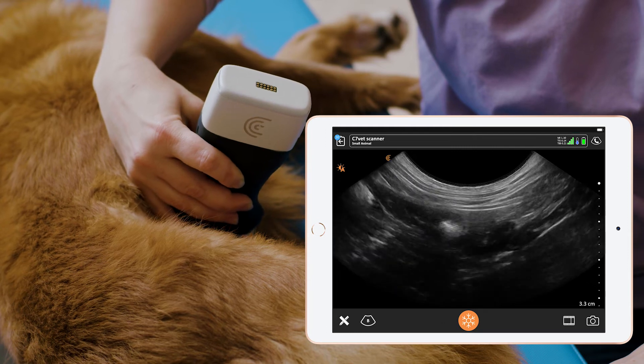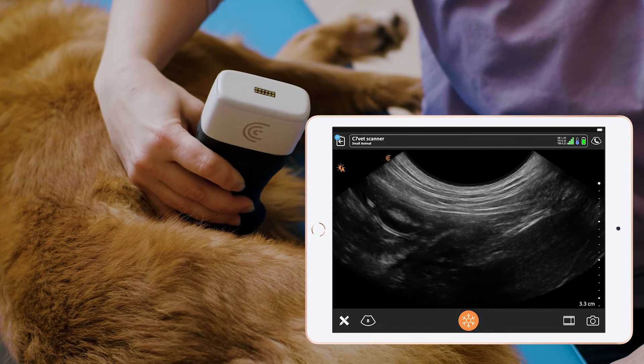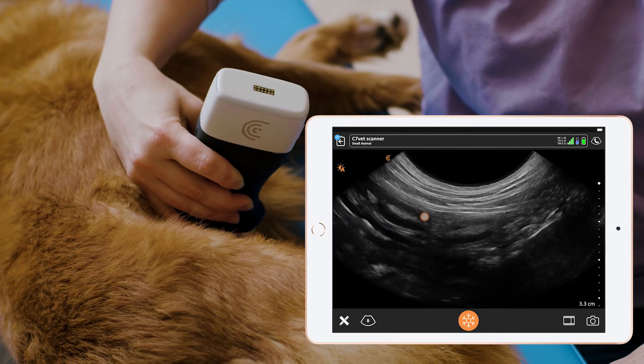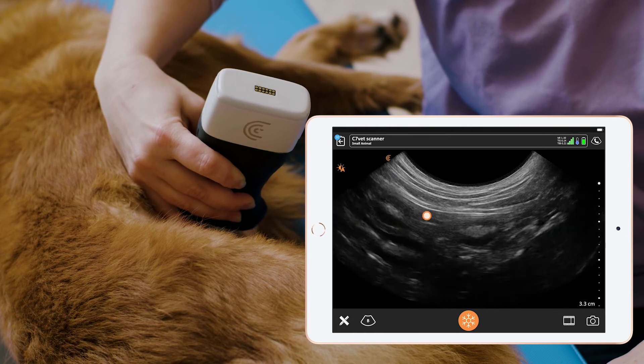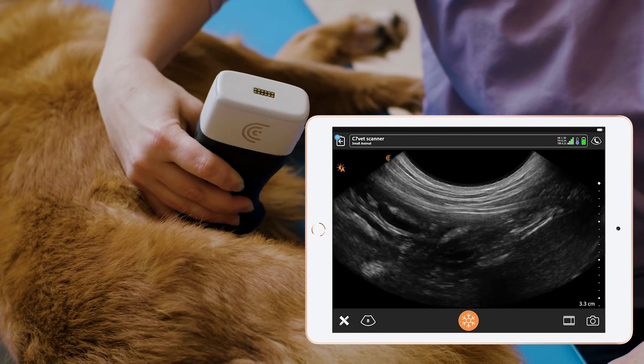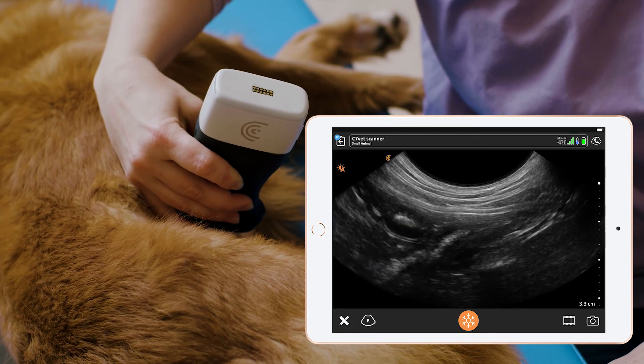We can see the right limb of the pancreas is very isoechoic. It has the pancreatic duodenal vein running through it, so there's a small anechoic structure in the centre of it, and that can help us to identify it particularly in the transverse view.